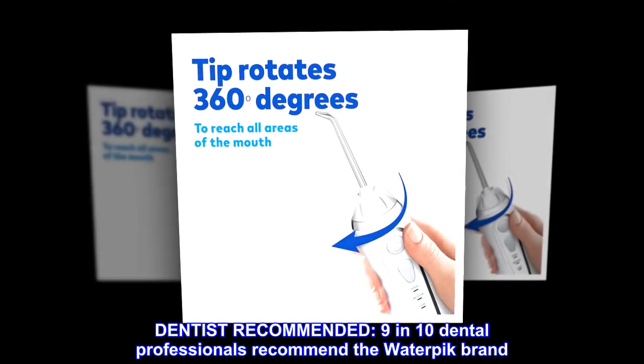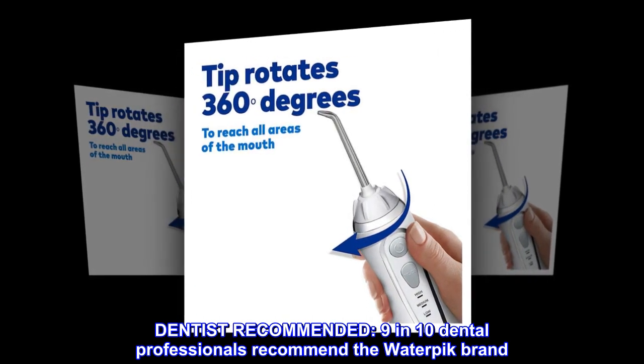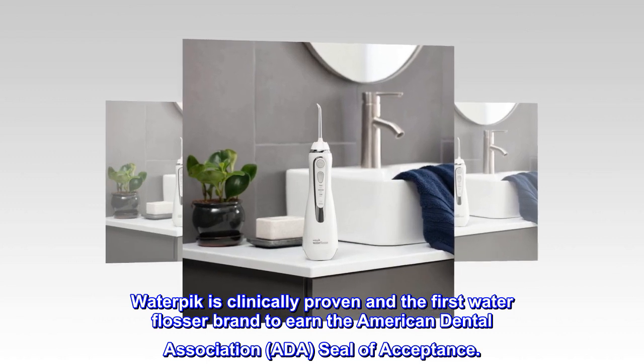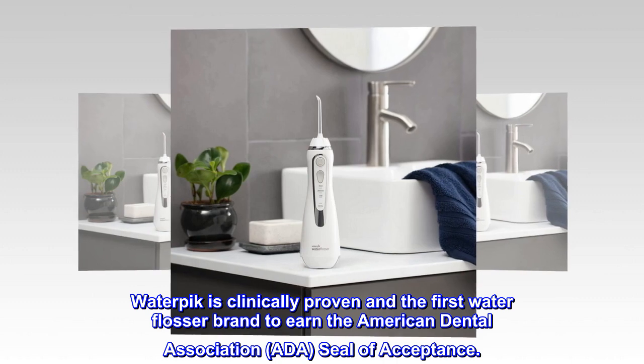Dentist recommended. 9 in 10 dental professionals recommend the Waterpik brand. Waterpik is clinically proven and the first water flosser brand to earn the American Dental Association (ADA) seal of acceptance.